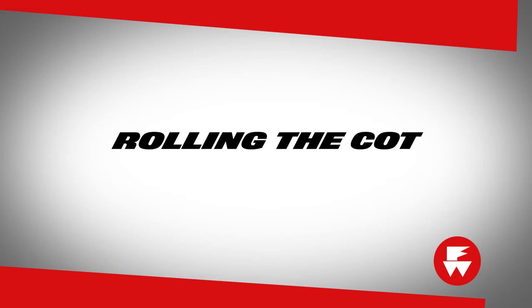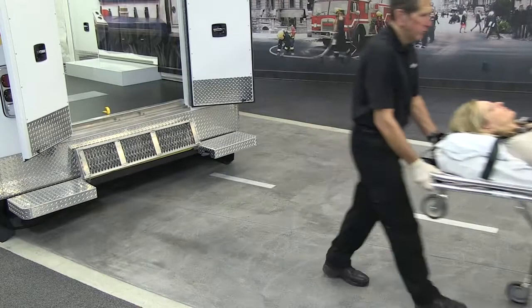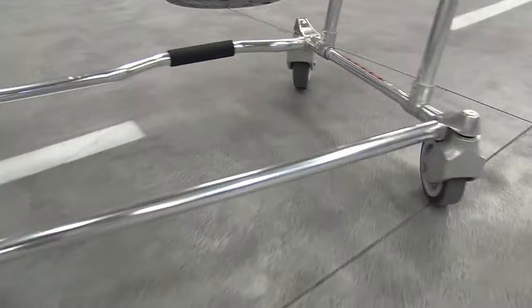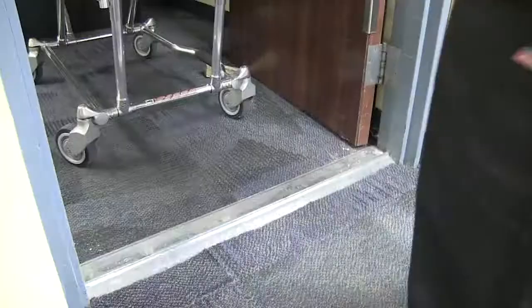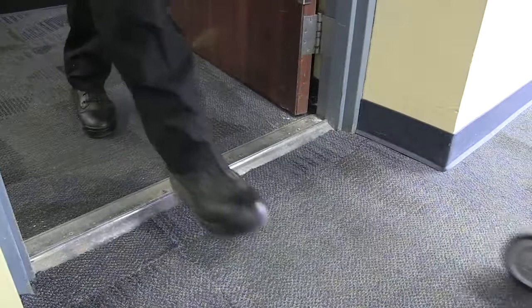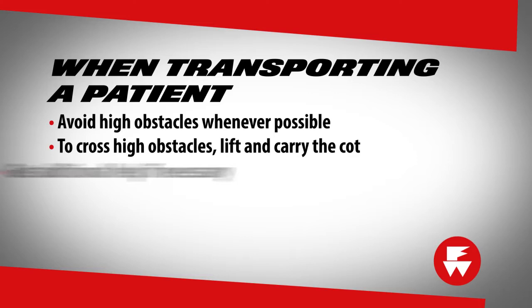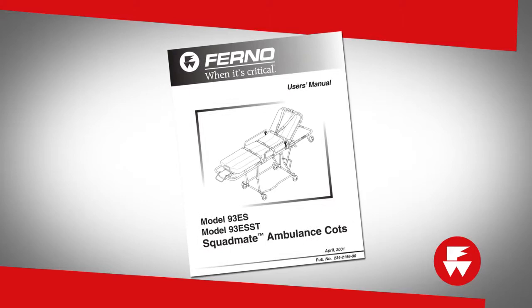To roll the cot, place the cot in one of the rolling positions. Be sure to use safe lifting techniques when lifting the loaded cot. The operator at the foot end pulls forward; the operator at the head end assists by pushing and helping to maintain control of the cot. Roll the cot on smooth surfaces whenever possible. Cross low obstacles such as door seals squarely and carefully by lifting and pulling the transport wheels over the obstacles. Avoid high obstacles such as curbs whenever possible. To cross high obstacles, lift and carry the cot. Get additional help if necessary. Refer to your user's manual for more information on the proper way to maneuver the cot when using additional help.